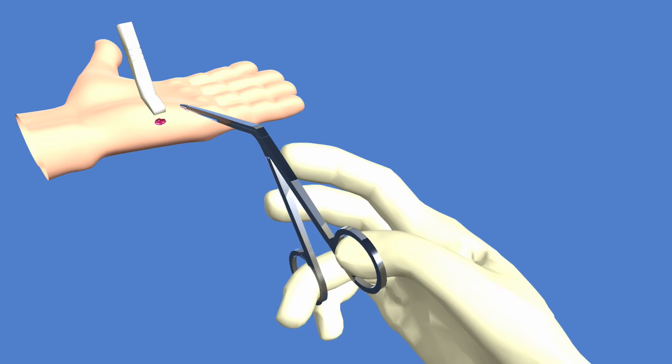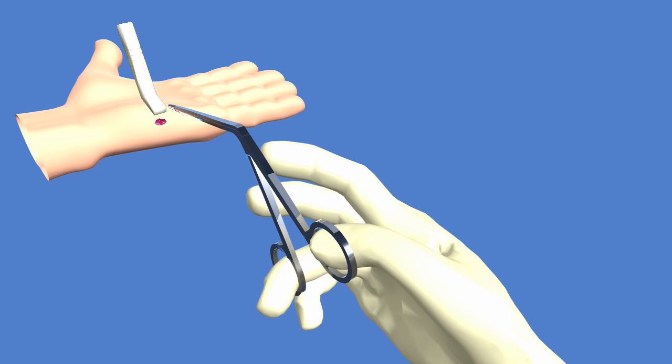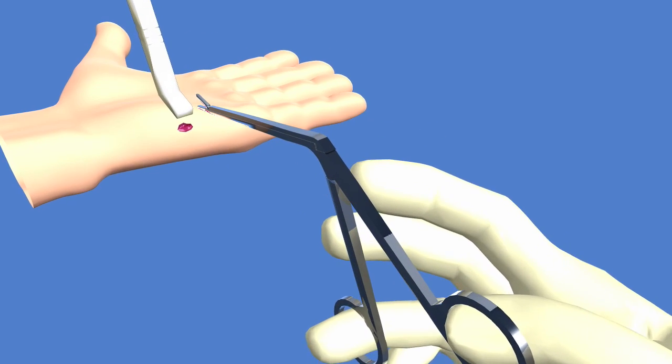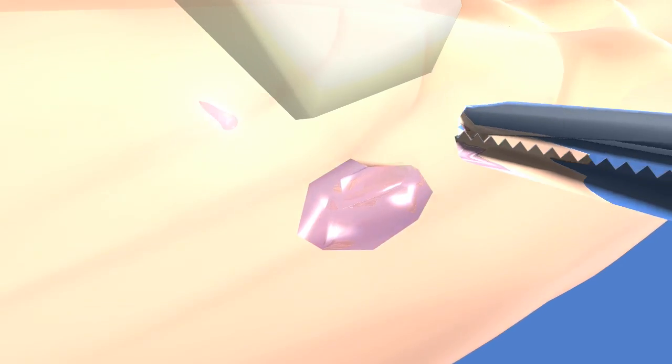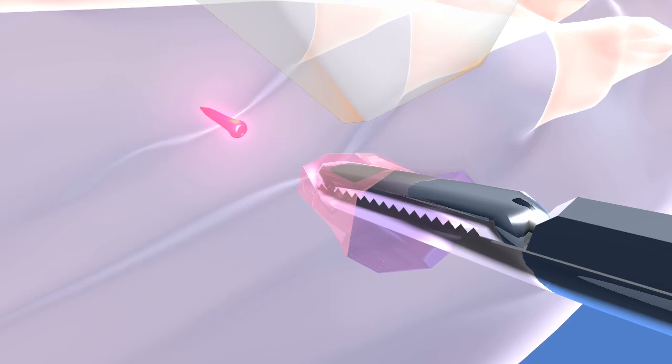The following animation illustrates ultrasound guided foreign body removal of a wooden fragment embedded in the hand. During ultrasound guided foreign body removal, after making a small incision in the skin.